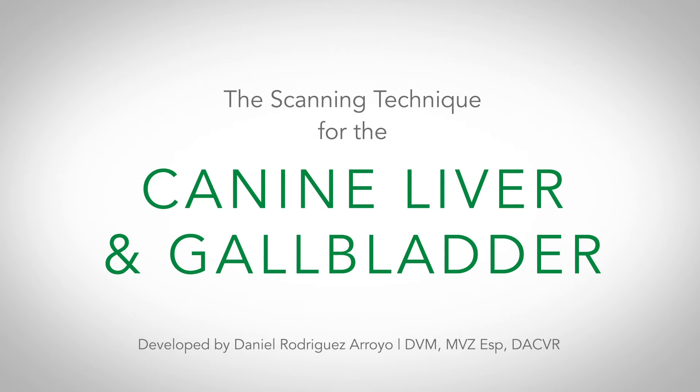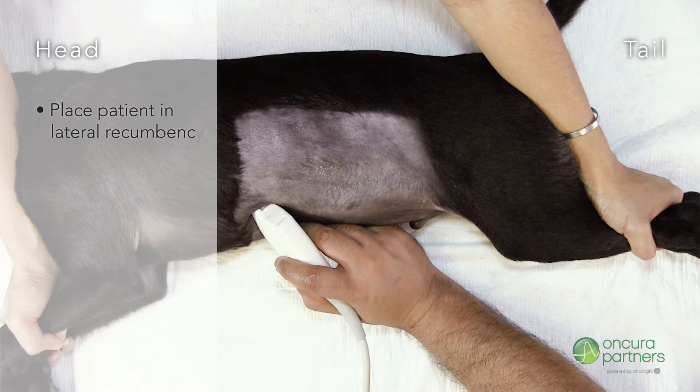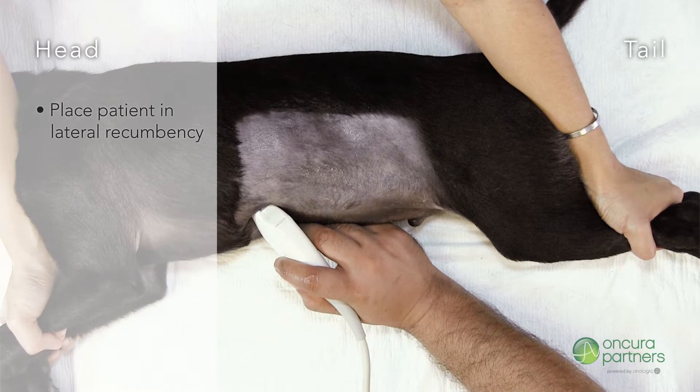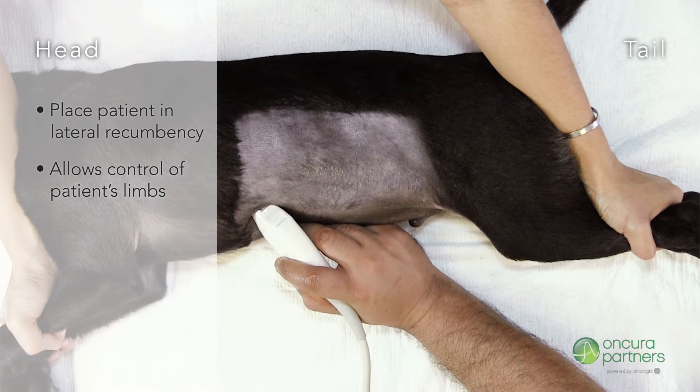The scanning technique for the liver and gallbladder in lateral recumbent canine patients. For this technique, the patient can be placed in either the right or left lateral recumbency with their legs directed towards the sonographer. This position will allow the holder to have complete control over the patient's front and hind limbs.